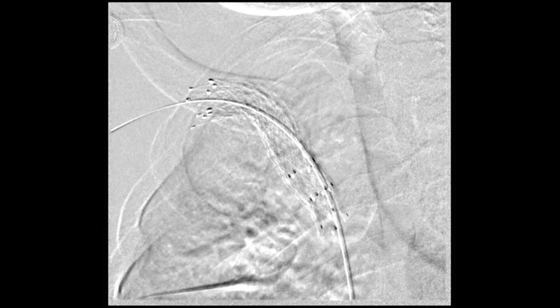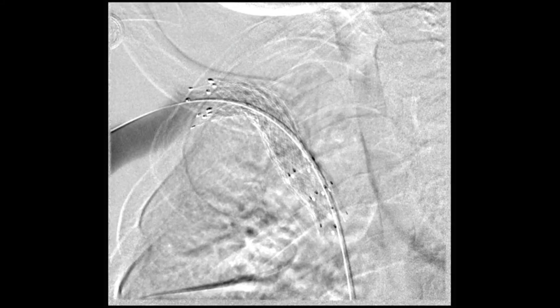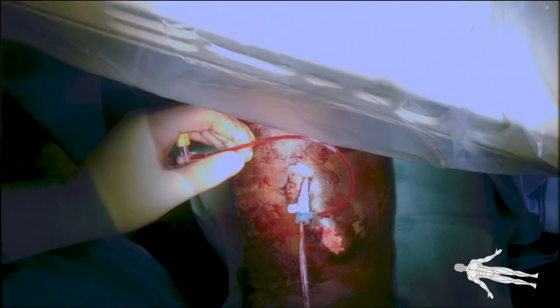Repeat angiography revealed complete resolution of the stenosis. The sheath was then withdrawn and manual pressure was held until hemostasis was achieved. Lastly, a sterile dressing was applied.